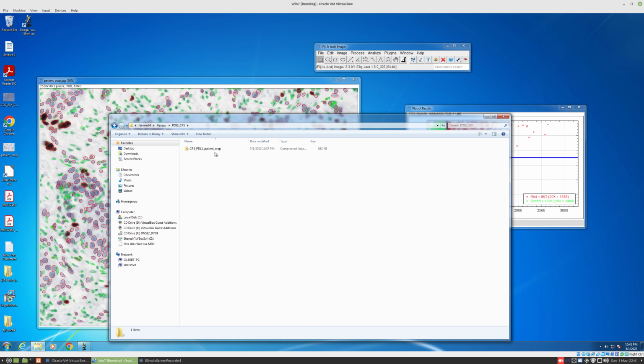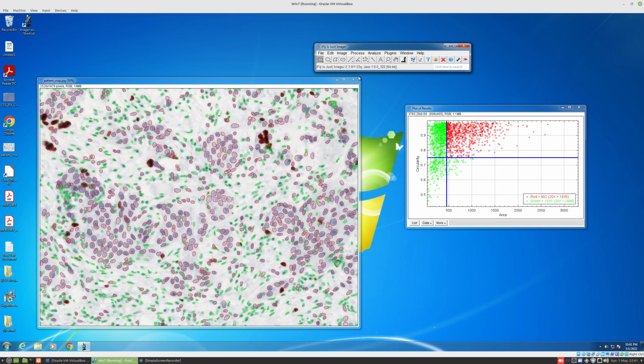So over time, you can have many of them if you open different images. And at one point, you may desire to remove all of them. So one icon here is to erase all the ROI. If I click on this, we will be asked, are you sure you want to erase this? Let's say OK. And you'll see the file has disappeared. Which means the next time I click on segmentation, there is no saved ROI, so the process will restart. We can take another example here.